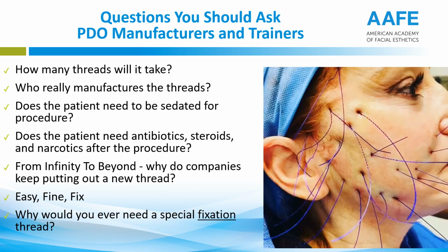But here are the important things, though. Now let's start talking about PDO threads themselves. And the first thing you need to know is that not all PDO threads are the same. Just because you say PDO threads, people assume, oh, it doesn't matter where I get them from. They are all the same. They are not. Some are much stronger. Some are much weaker. And again, I'm going to show you everything from some other companies so you can decide for yourselves. And certainly many of you have been trained on PDO threads in the past.